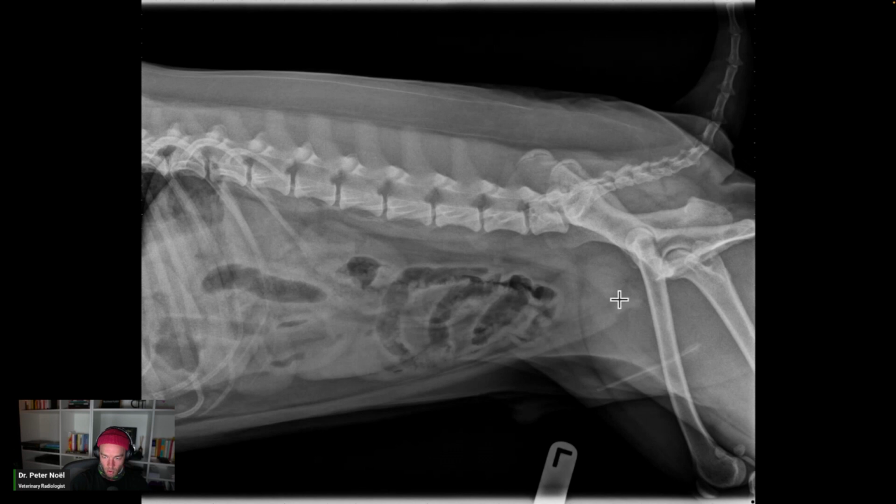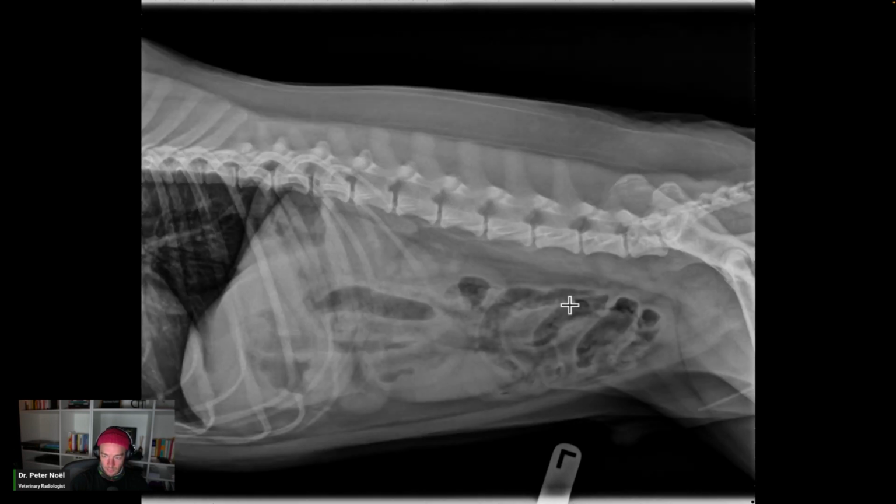Urinary bladder, small and fluid opaque. Colon, I kind of lose it. I don't know. That could be it for sure. This could be it for sure. I kind of lose it. But what's not it? These things. Not it. Stomach right here. Okay. Left lateral view. Pylorus gas filled. This is probably the pylorus, it comes up and then it dumps into the duodenum like that.